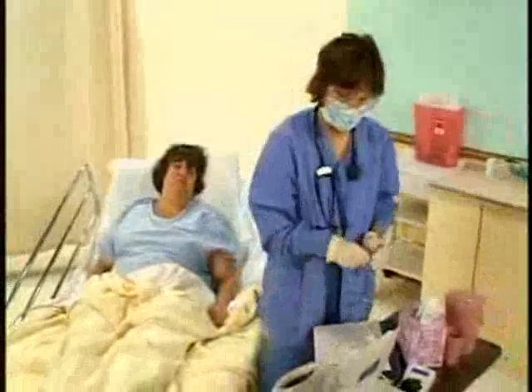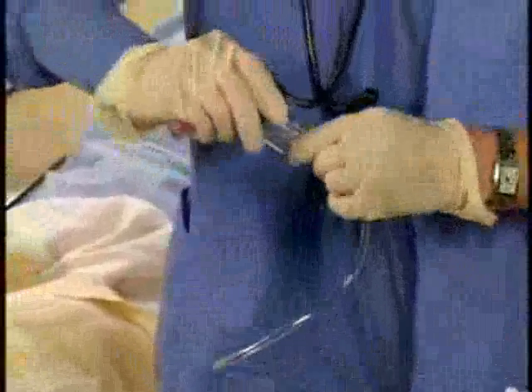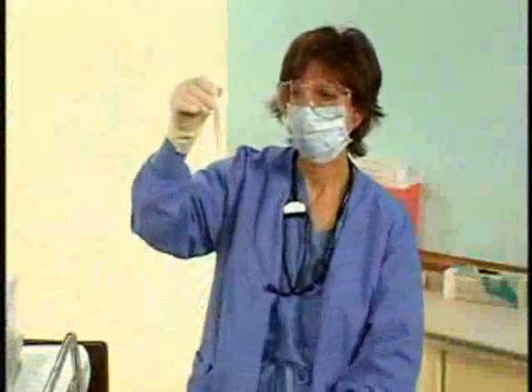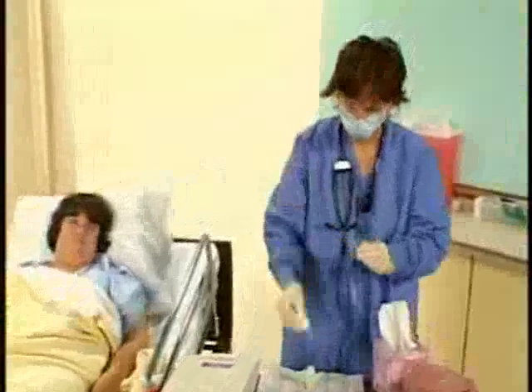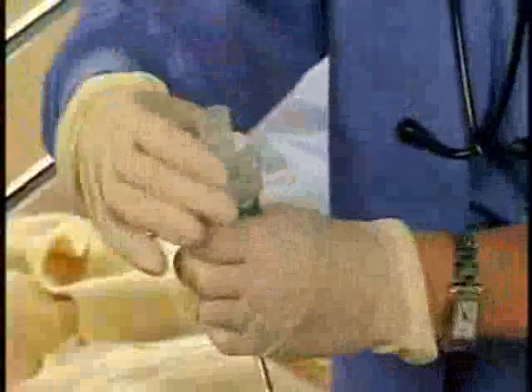Attach the tubing to the bottom of the nebulizer cup and attach the other end to the air compressor or wall air. Look at the medication at eye level if using a dropper to dispense the solution into the nebulizer. Determine the correct amount of medicine and pour the entire amount into the nebulizer cup carefully so you avoid touching the drug. To prevent spillage, cover the cup with the cap and fasten it.